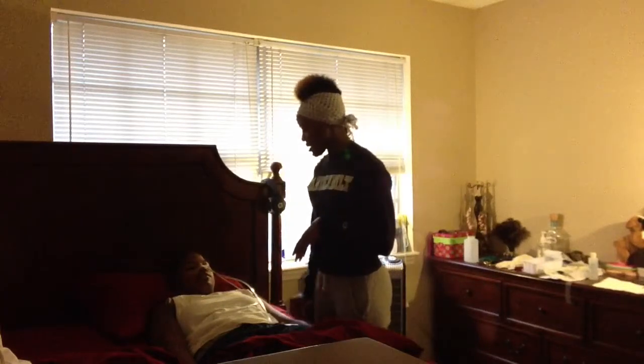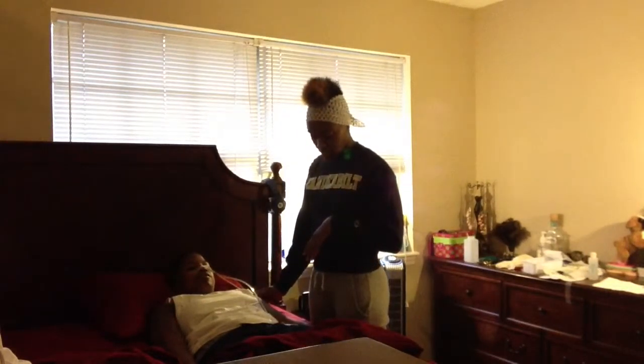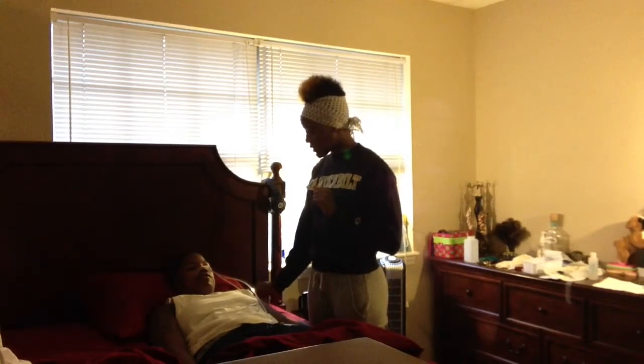I'm going to put Ruby back in a comfortable position and explain to Ruby that the discomfort should decrease with time. And I need to let Ruby know to let a nurse know if the tube ever becomes entangled or if she ever starts to feel any discomfort, if the tube starts to come off, just to let someone know. Also, I need to explain the importance of oral care.